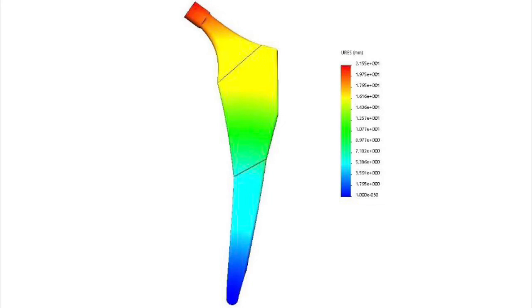In this part are my results for the displacement for my stem. In the upper part of the stem, the femoral head, we notice that it has a bit of an impact due to the weight I used of 2000 newtons, so this could be something to take into consideration. However, on the lower part of the stem, I noticed that it is more secured, meaning that the stem itself is much stronger than before.